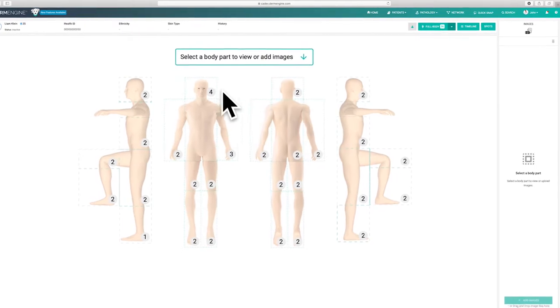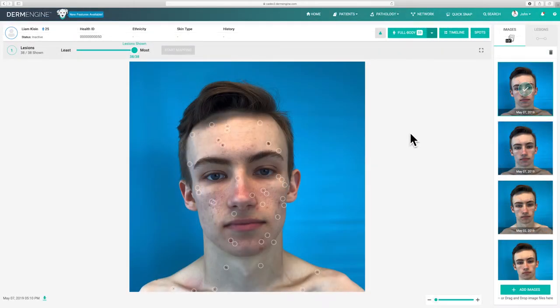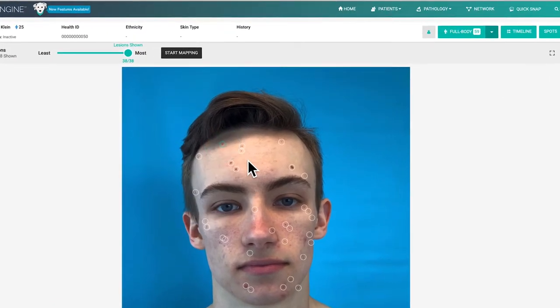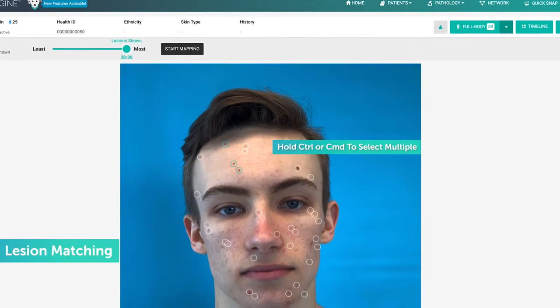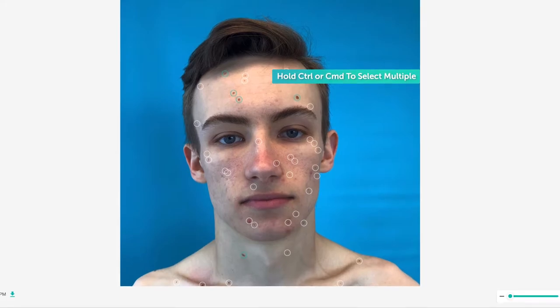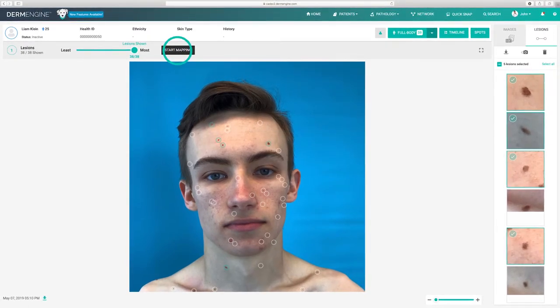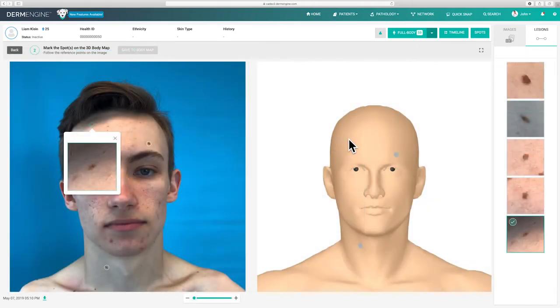Select a body part and the image you would like to map to the 3D body map. You can select a spot by clicking on it, where you'll notice a teal circle appear around it. To document multiple spots at once, hold CTRL on Windows or CMD on Mac and click on as many spots as you'd like. When ready, click start mapping. One by one, DermEngine will highlight the selected lesions on the image and prompt you to place the corresponding spot on the patient's body map.